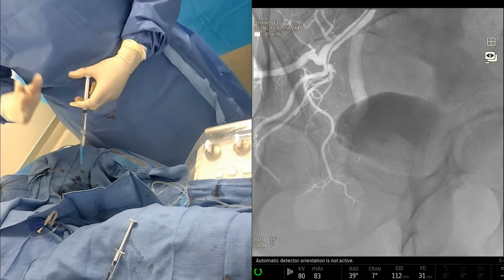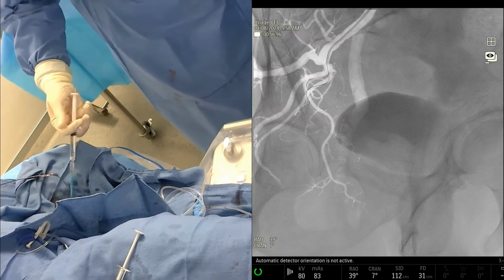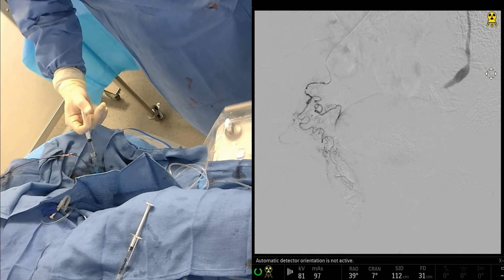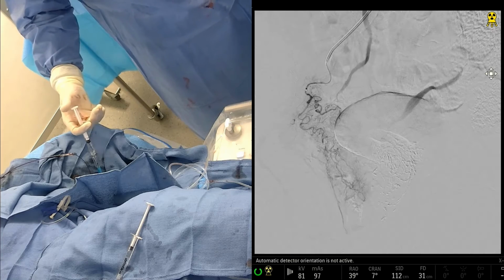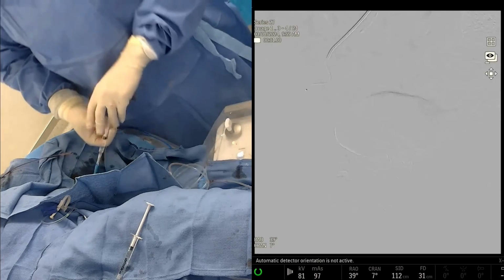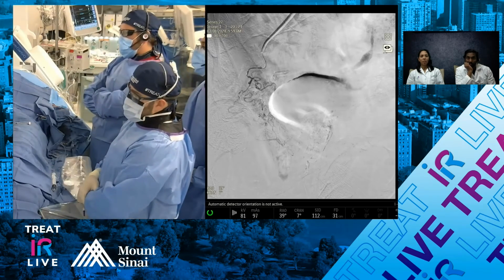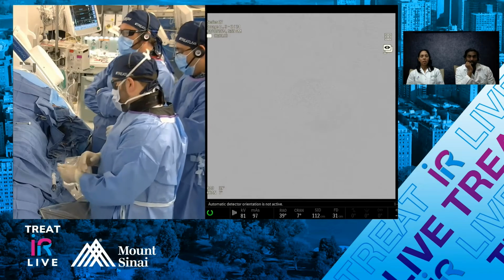When we see two vessels that look like the prostate, the one that's posterior is usually the rectal. They both have an S shape, but we'll see. It's rectal. Definitely rectal. I don't think you need a cone beam CT for that. What do you guys think? There might be a little prostate off there at the bottom, maybe a little bit, but that very straight medial-going branch is fairly rectal characteristic, right? And you have the option of glue on the other side.